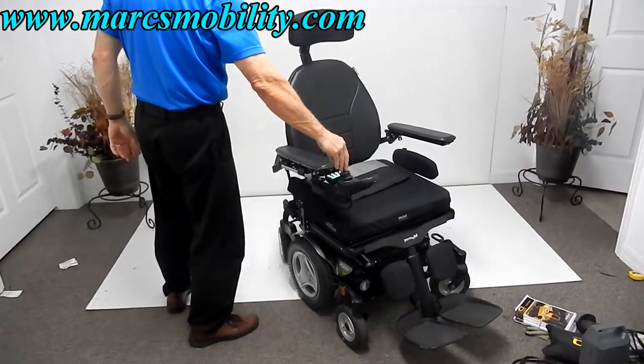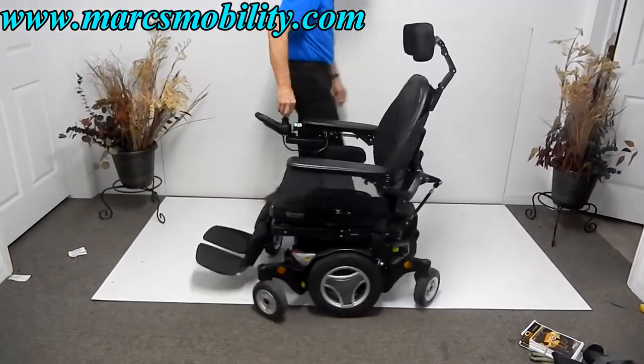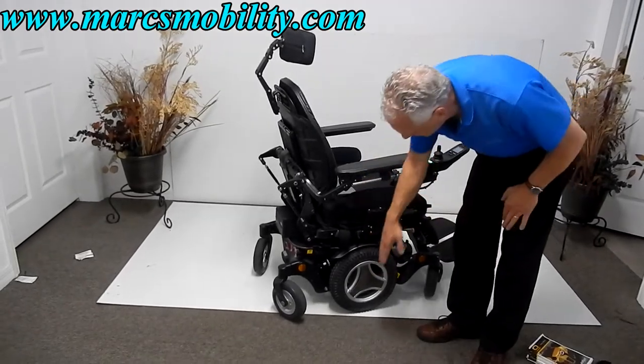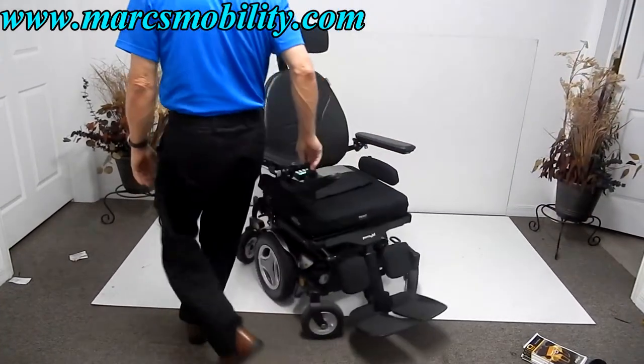This would be your turning radius on this chair. This is considered a mid-wheel drive, so your motors are in the middle of the chair and it turns around the middle axis. Whatever the length of the chair is, that's what it turns around.